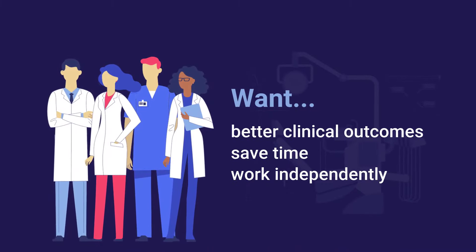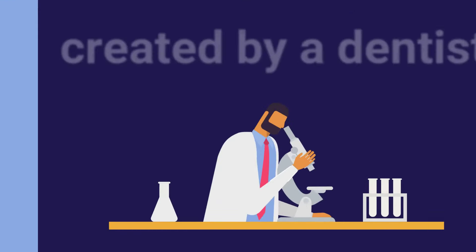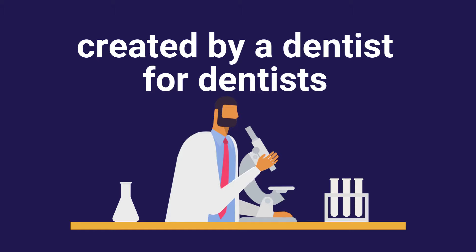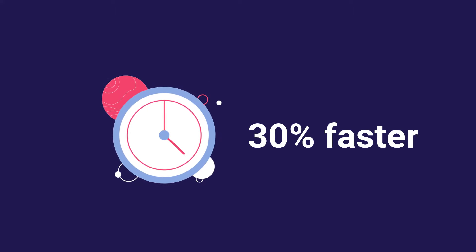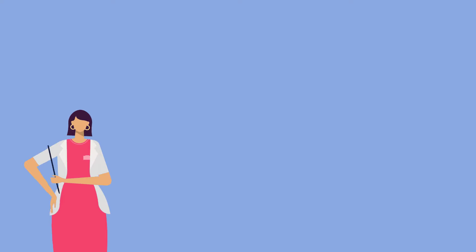Want to achieve better clinical outcomes, save time, and work independently? You can! A clinician like you created Isolite Systems because he didn't want to break his back or his bank. Isolite effectively isolates the oral field, helping you complete procedures 30% faster as the only person working in a patient's mouth.